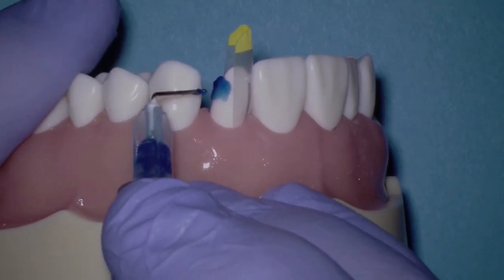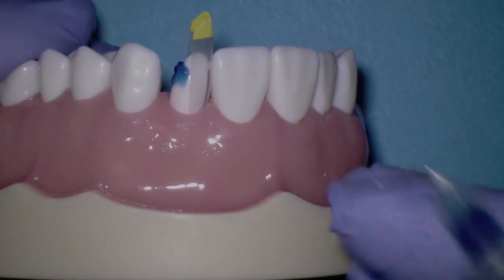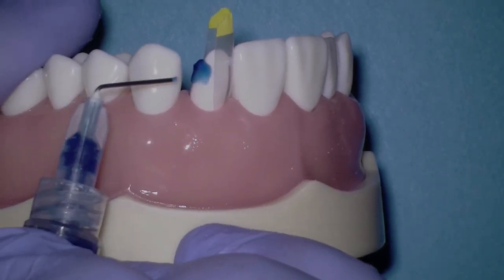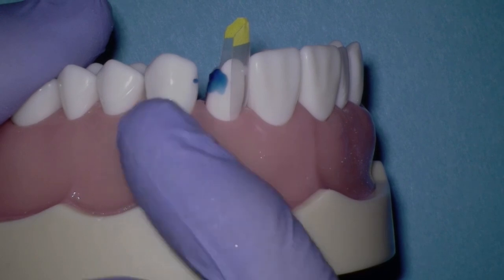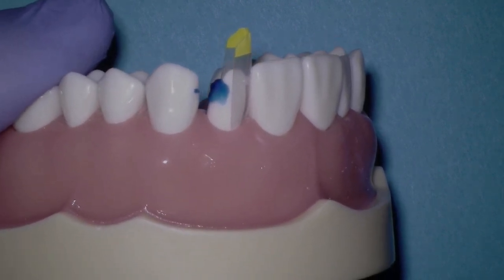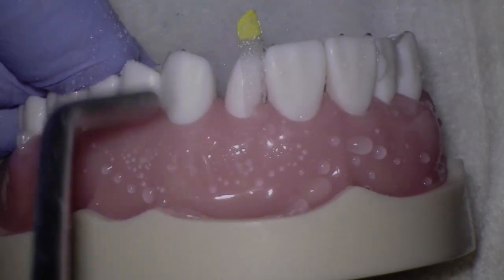In this case, we're going to be hitting at the heart of the contact on the canine, which will be slightly further gingival than it was for the central incisor because of the anatomy of the canine. So we'll be in this zone here for the canine. Once again, a little bit lower on the tooth because that's going to be the heart of the future contact on the canine. So after etching for 15 seconds, we'll go ahead and rinse and dry.